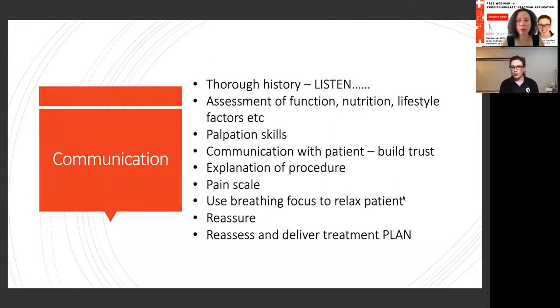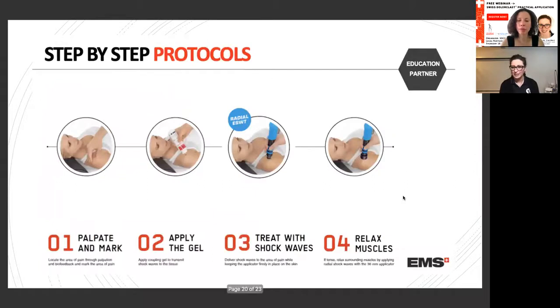So our protocols, I'm going to show you this on the patient. It's important that we palpate the area where we're going to shockwave so we know exactly, and we don't lose our spot. We apply gel, we treat with the shockwave, and we can relax the muscles around the area if we look ahead sometimes. So I'll show you how I do that. We're going to now go over these. The first one we're going to talk about is knee osteoarthritis.